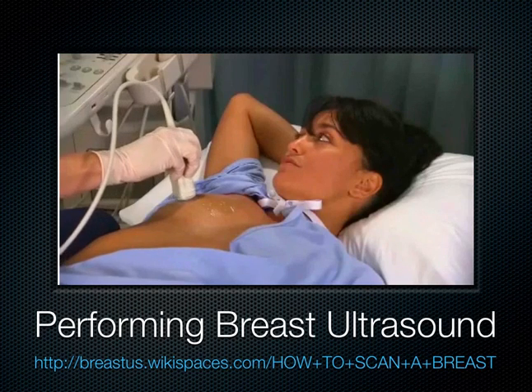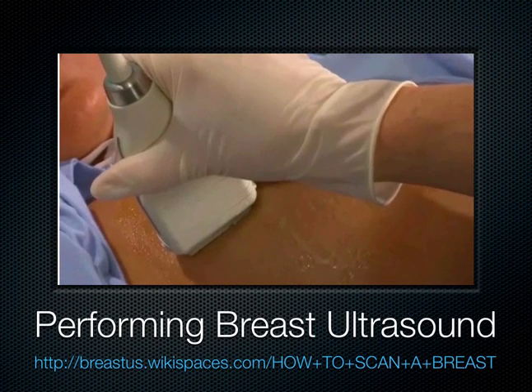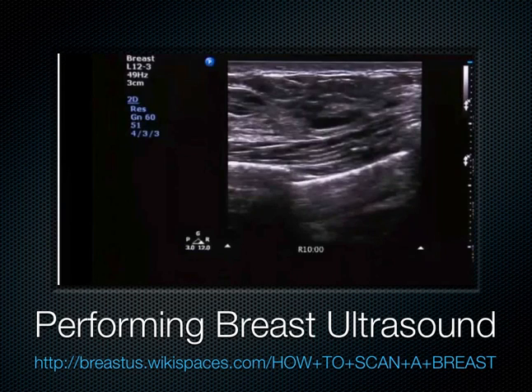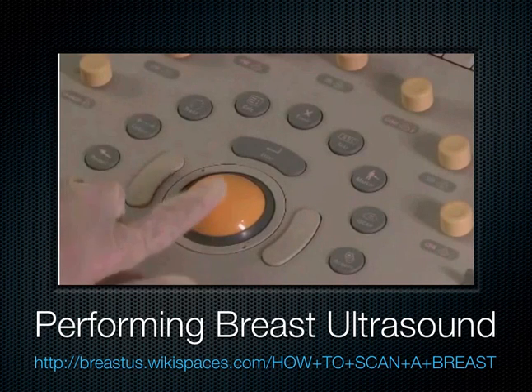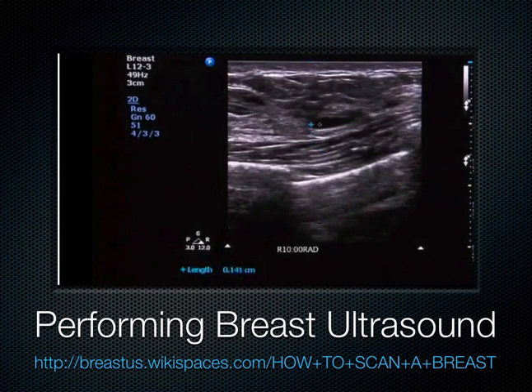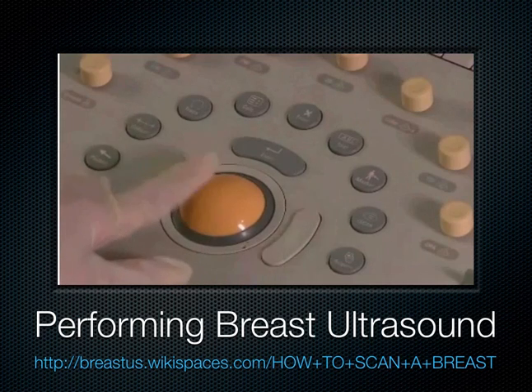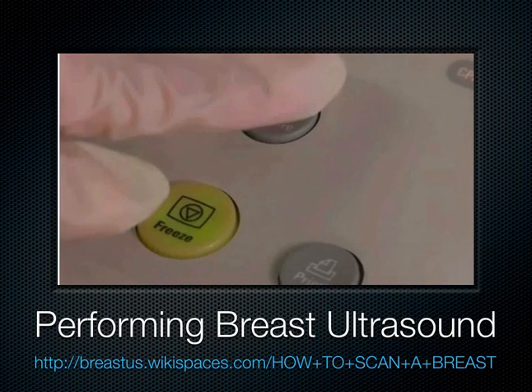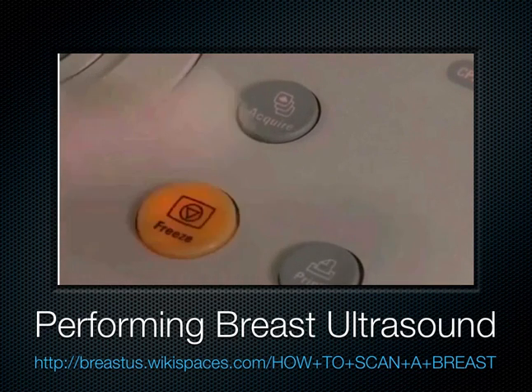If a lesion is encountered, manipulate the transducer and optimize the image. Freeze and annotate according to the protocol. Measure the length of the lesion by placing 2 calipers on the superior and inferior margins of the mass. Measure the height of the lesion by placing 2 calipers on the anterior and posterior margins of the mass. Save the image and unfreeze to continue.